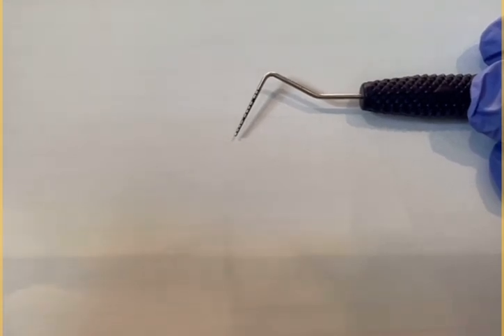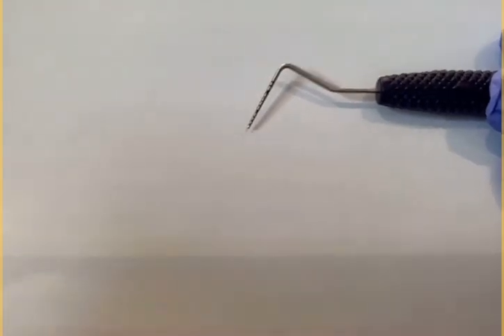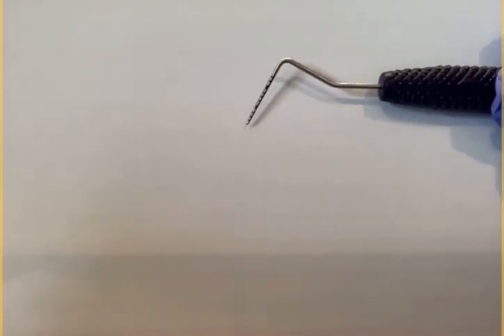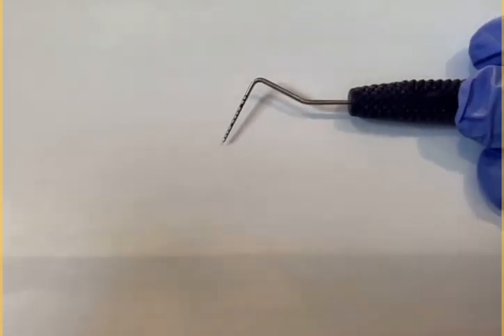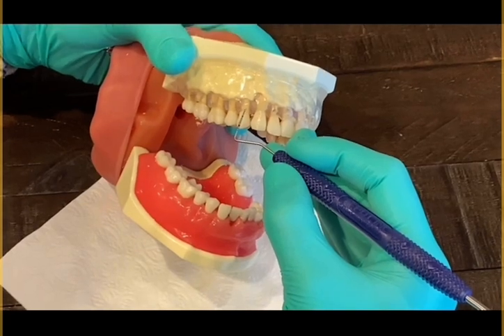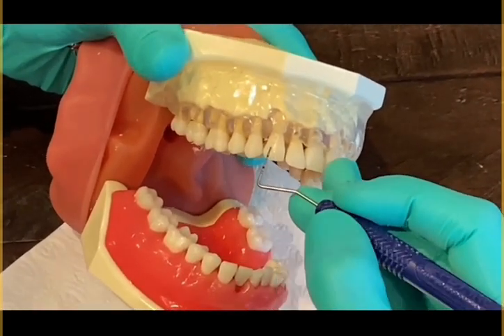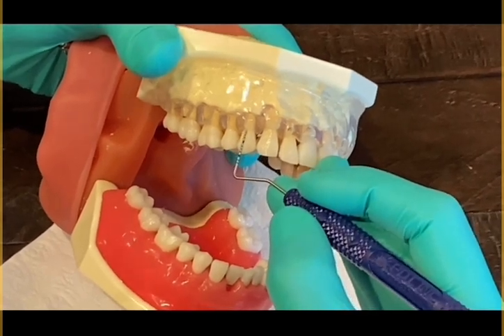On a live patient, you see tissue blanching when you are at the junctional epithelium. Probing order when probing the full mouth is 1 to 16 buccal, 16 to 1 lingual, 32 to 17 buccal, and then 17 to 32 lingual. I am now going to demonstrate how to use the periodontal probe. I'm going to be probing teeth 5 and 6, and I'm going to start on number 5.